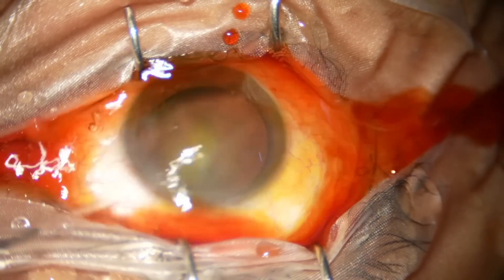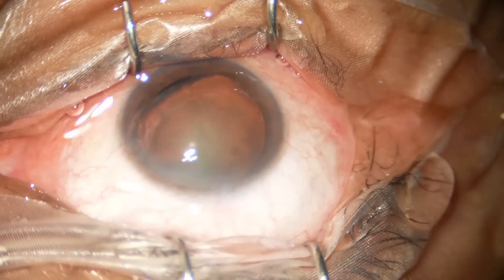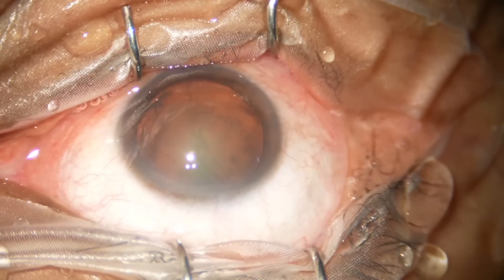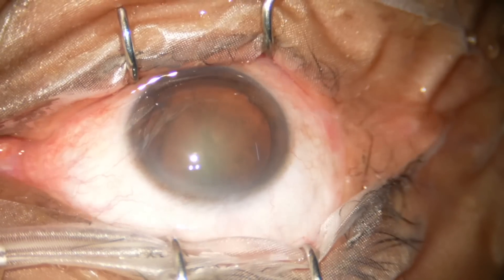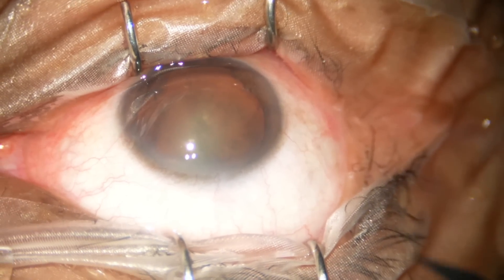The microscope is Lumera T from Zeiss and the phaco machine is Oertly Cataract 3. We are going to do the surgery under topical anesthesia.